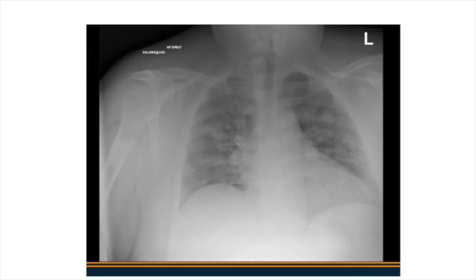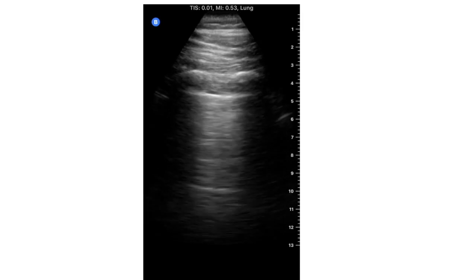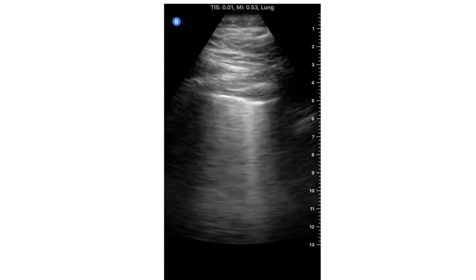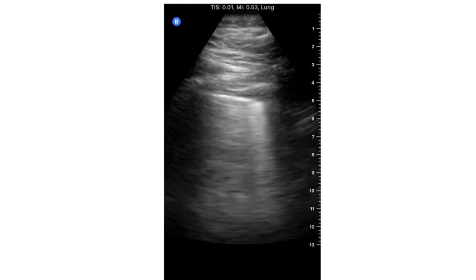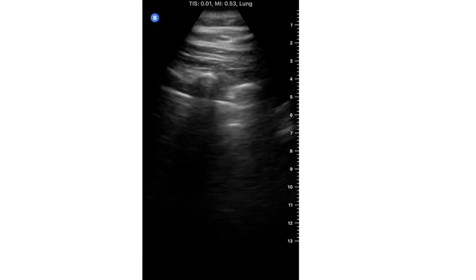The next case is a young chap who, again, that's his x-ray, and you can see he's got extensive pulmonary infiltrates and classic COVID symptoms, and this is his scan, and he's got beautiful A-lines there, reassuring me that I'm happy to let him go home because he's off oxygen and he's getting better. You can see though in the lower zones he's still got some B-lines, but he's well, and this should take time to recover. And that's another upper zone for him, and we can see some A-lines.